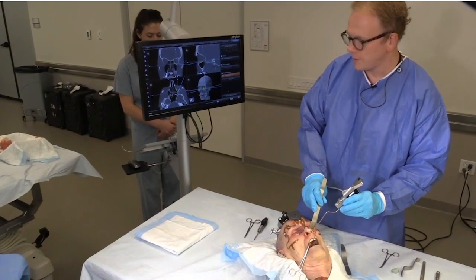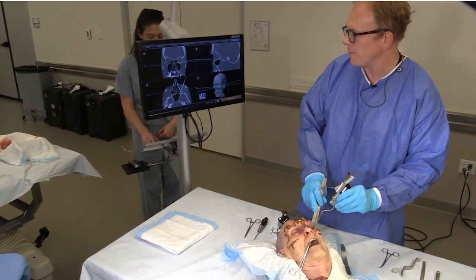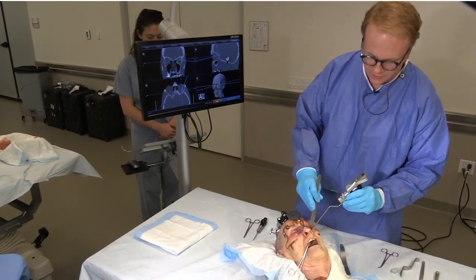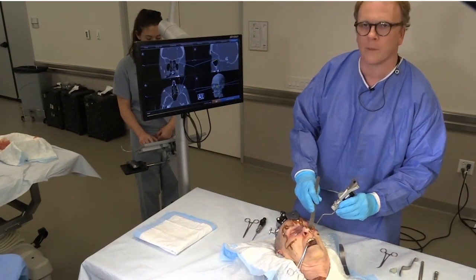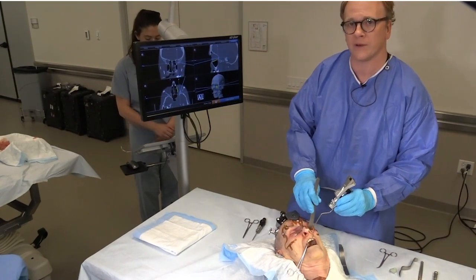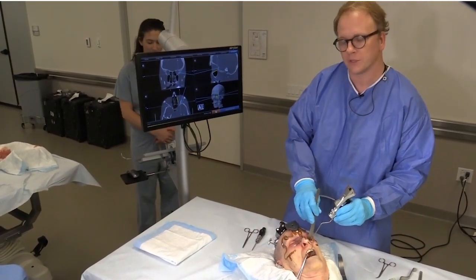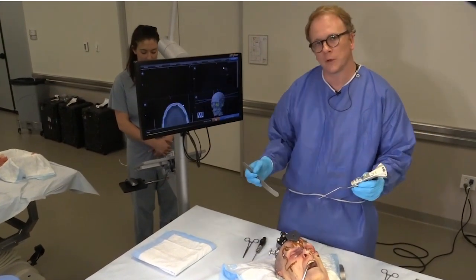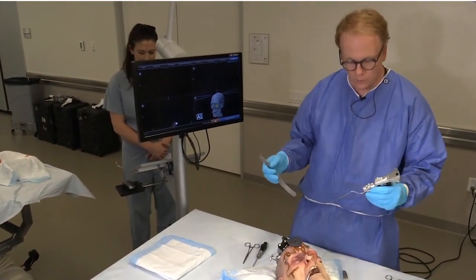Navigation can make the process of dissecting one of these fractures much easier, particularly for the novice orbit surgeon. Simply by placing the probe, I can get a sense of where I am. Most surgeons beginning to dissect orbits — particularly trainees — will think they're very deep in the orbit and close to the optic canal when in fact they're quite remote from it. This helps a surgeon adequately dissect and fully expose all bony ledges for a proper orbit reconstruction.